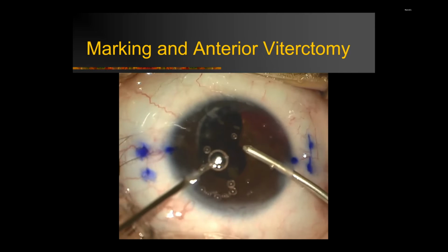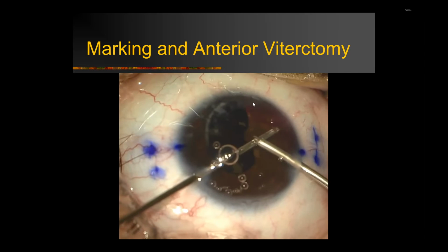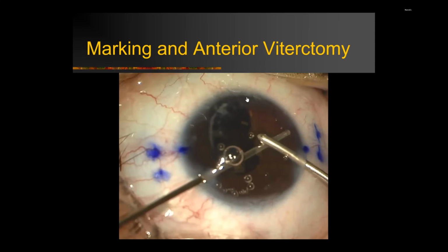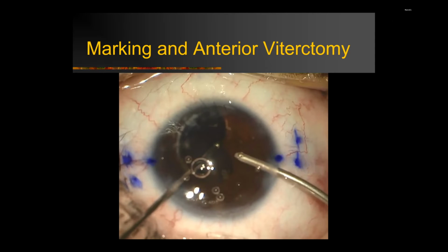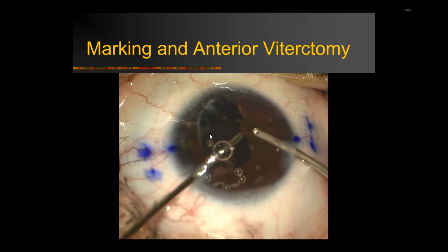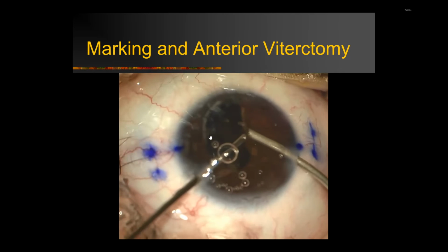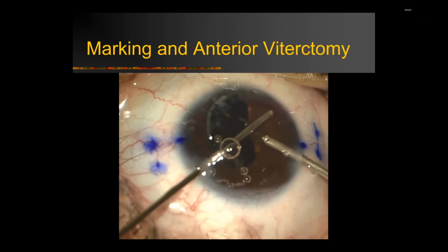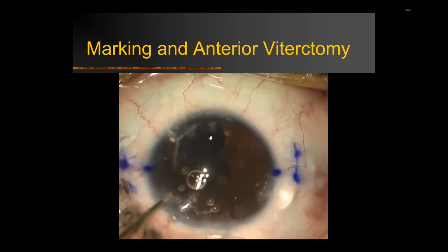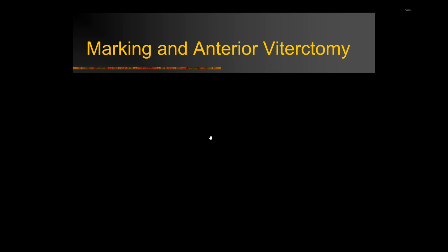the capsule. In this case, the initial injury was repaired a week before at primary repair, as you can see. For the Yamani technique, it's important to do a good vitrectomy so as to avoid the entrapment of the vitreous into the lens.